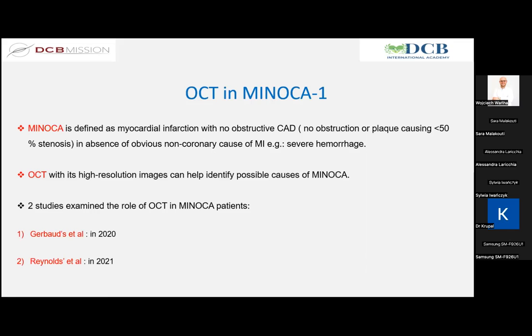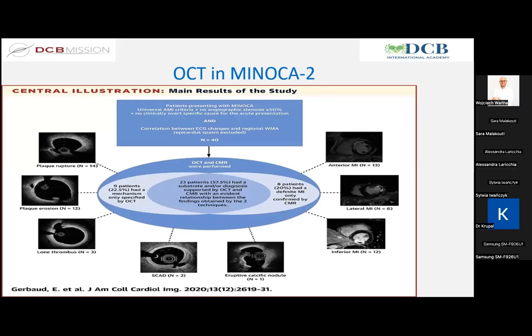Last thing, OCT in MINOCA. OCT with high resolution can help identify possible causes of MINOCA. Two studies examine the role of OCT in MINOCA. The first was by Gerbaud et al. in 2020, second Reynolds in 2021. This is a study by Gerbaud et al. It included 40 patients with MINOCA.